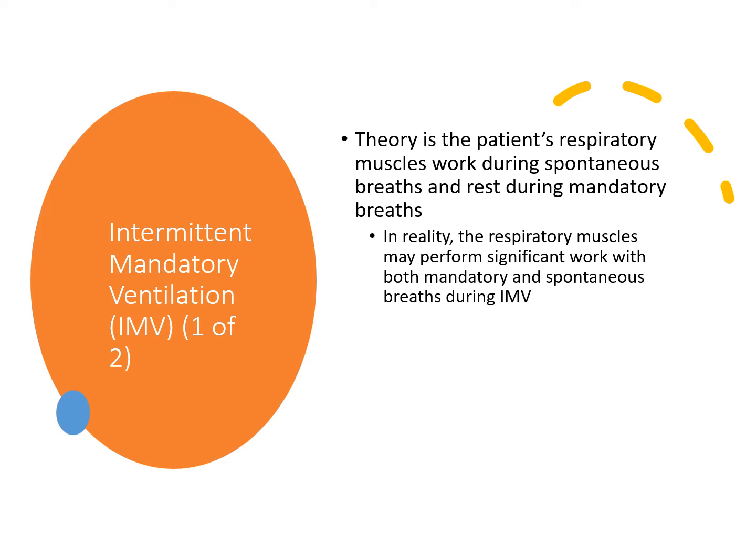So usually when the IMV rate is 4 to 6 breaths a minute, then usually you're looking at a wean, with the patient breathing on their own with just very, very minimal support. When we're looking at this, the pressure support ranges that we typically use are around 5 to 10 centimeters of water pressure. And then that just depends on what tidal volume we're looking for.